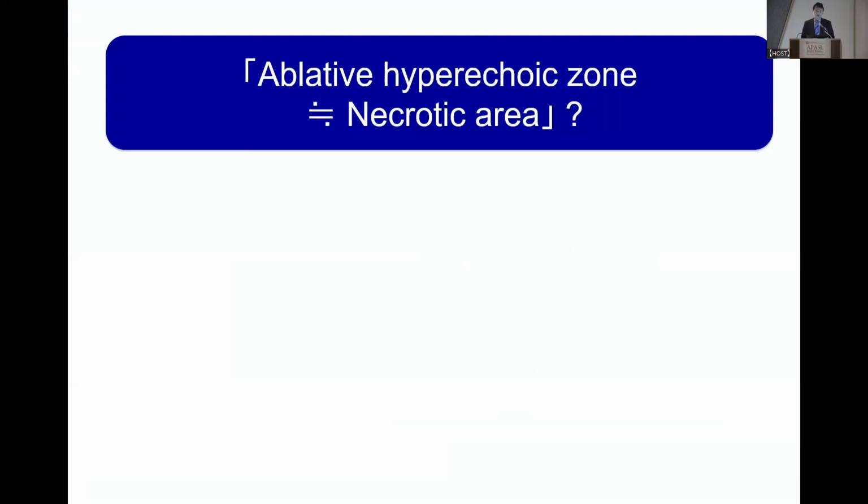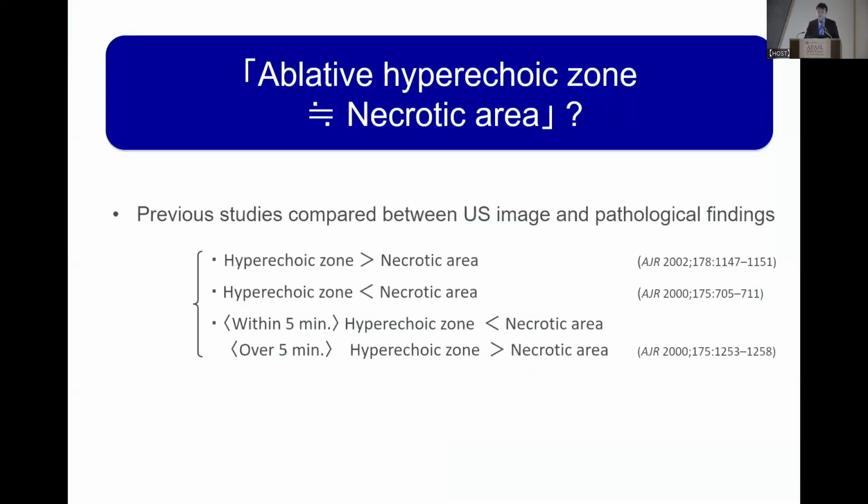Is the ablative hyperechoic zone equal to the necrotic area? Previous studies compared ultrasound images and pathological findings. One paper said ultrasound overestimated the ablation zone. However, another said ultrasound underestimated it.